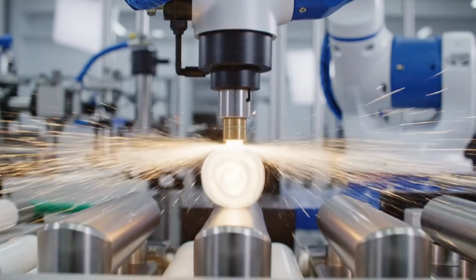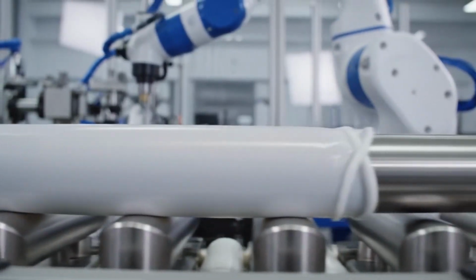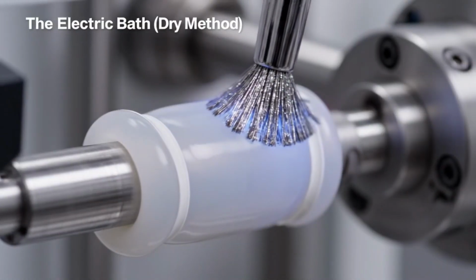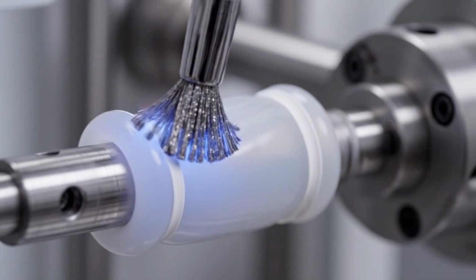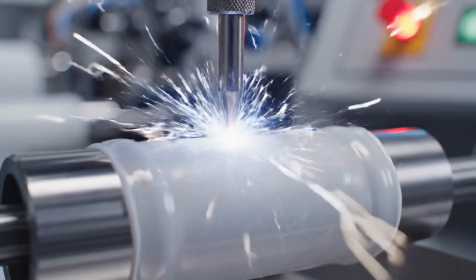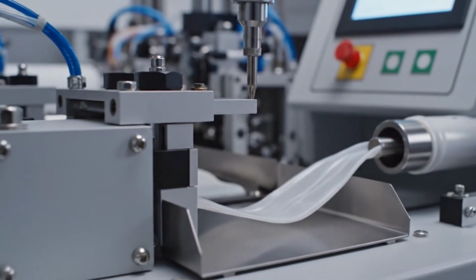Proper mounting is vital. The rubber must be stretched to its limit to expose even the tiniest microscopic hole. If the rubber is perfect, it acts as an insulator, and no electricity passes through. Even a hole invisible to the human eye will allow a spark to pass. The machine detects it instantly.